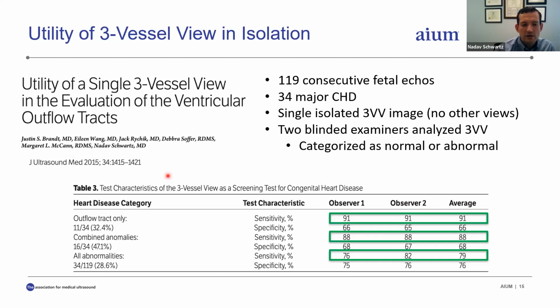So I think that this hopefully convinces you of the strong power that this three-vessel view has in order to help you, work on incorporating it into your screening and diagnostic capabilities in your unit.